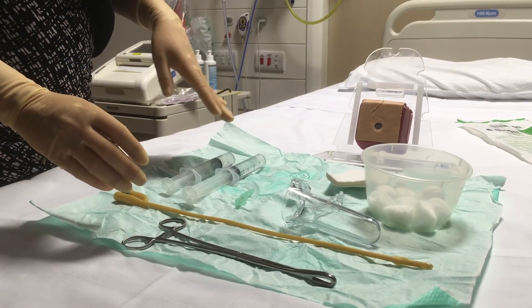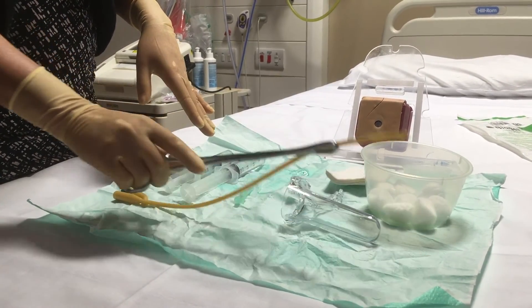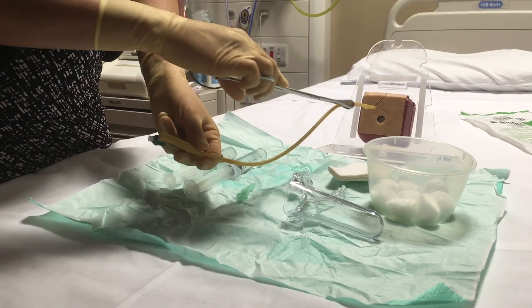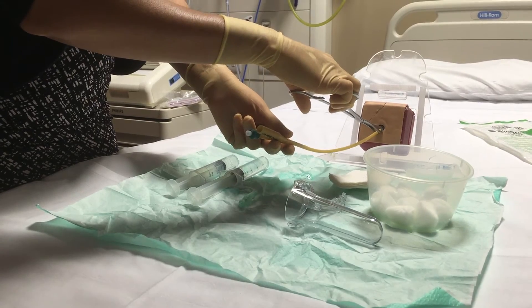We're going to be using this model as our cervical os. Once you can see the cervical os, you're going to take the sponge holder and hold the catheter, making sure that you're holding it beyond the balloon tip. After that, insert the catheter through the cervical os and push it in as far as it can go.